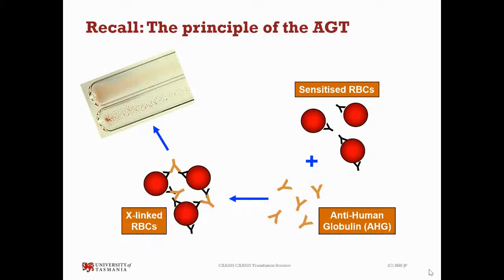Okay, so first of all, what I'd like you to do is to describe this image to me, starting off. So this is just some recalling from our lecture the other day. So our sensitized red cells here. Starting off from this image, I would like you to describe what you see on that slide.